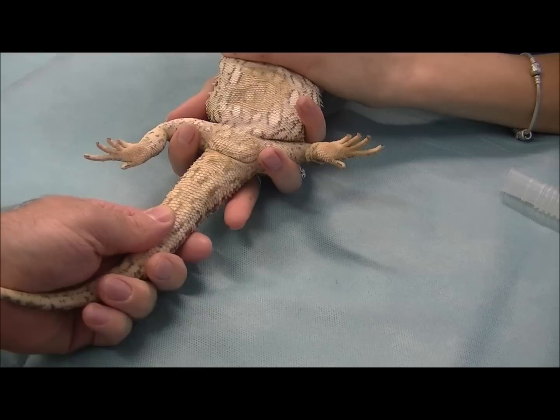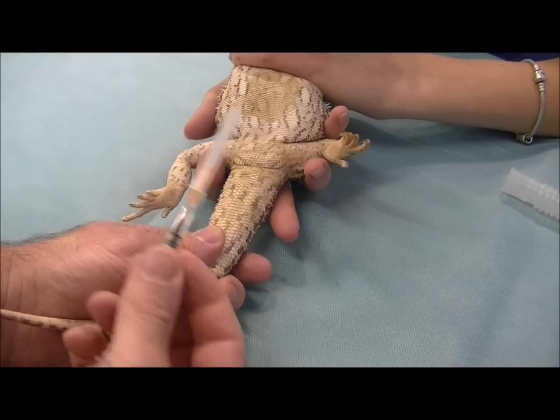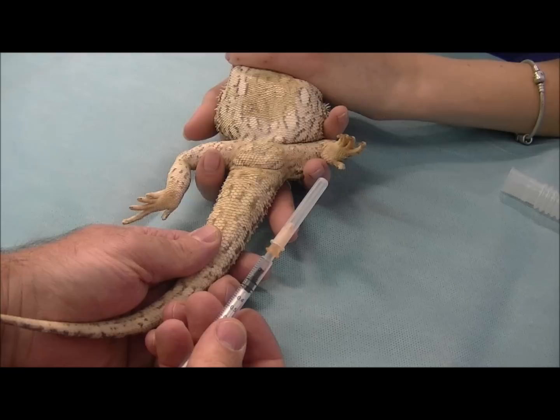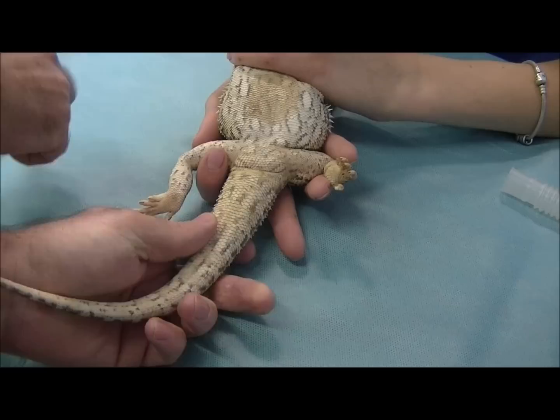We've got Icy ready to give her anaesthesia. She's a bit of a wriggle bum. Dragons generally don't like being placed on their back, so we're going to show you how we anaesthetise lizards. We've got her on her back. I'm going to be aiming for a vein on the underside of the tail. We're going to use an injection of a drug called L-faxan — for vet nurses watching, it's about 4 to 5 milligrams per kilo, so we'll give her about 0.2 of a mil. Hopefully we get that intravenous, and in about 10 to 30 seconds she'll be asleep and we can intubate her.